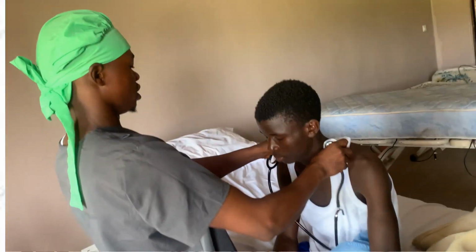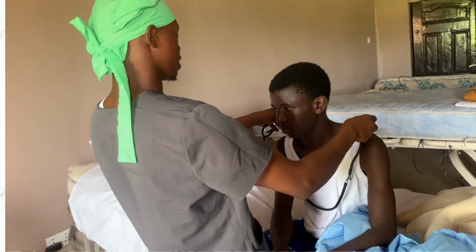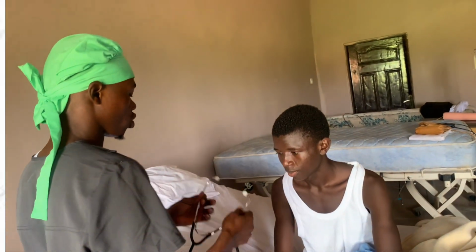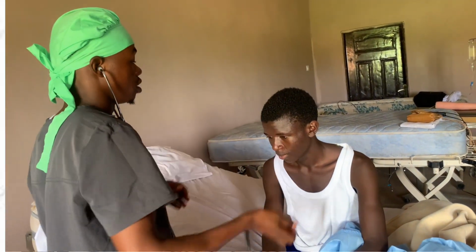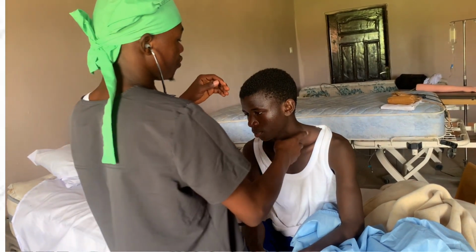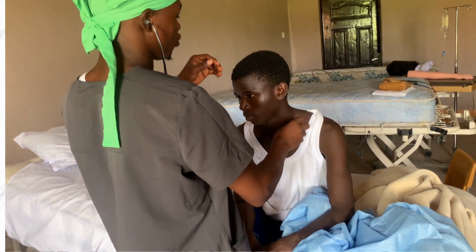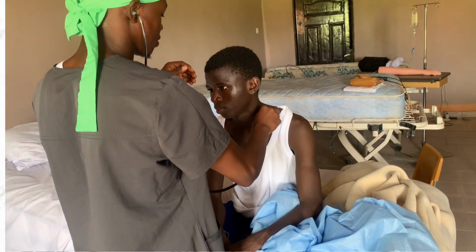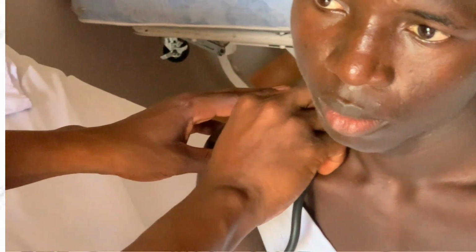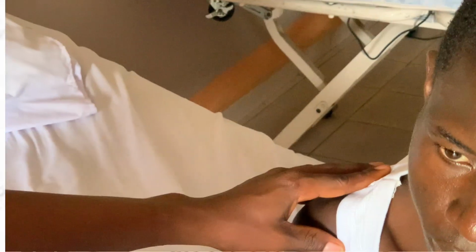So on the anterior view of the patient, I start also with the apex. I auscultate the apex of the lungs, which is always above the mid-clavicular line, above the clavicle here. If you want to auscultate the trachea, you can also do so, and you can find the sound of the trachea here.